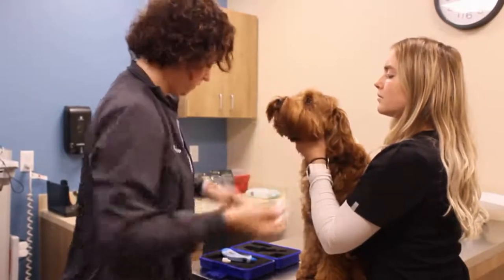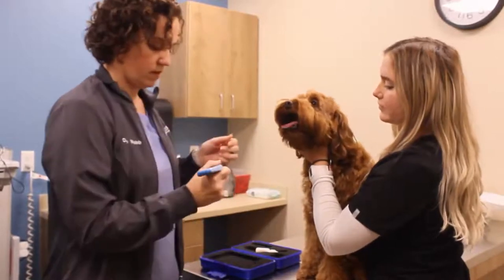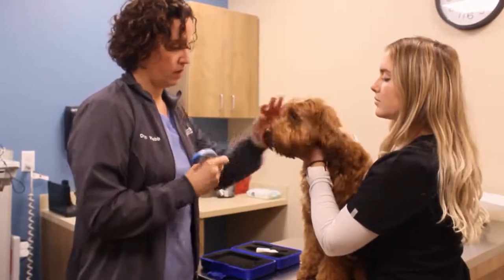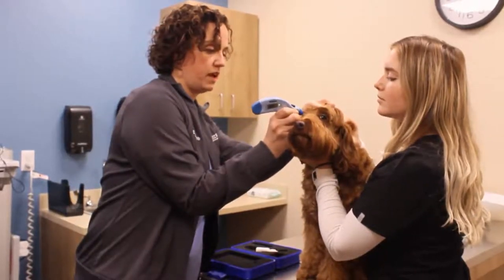We let those drops work for a few seconds, and then we measure each eye individually.